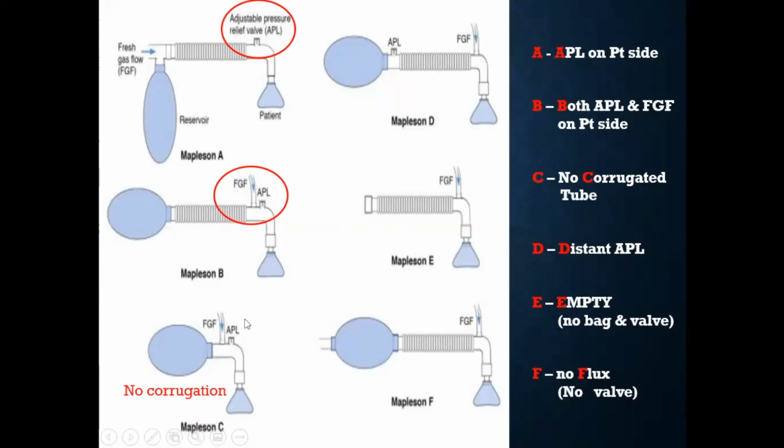Okay. Next, D, distant APL. This is a complete system again, but the APL is away. If you see in all the systems, only in D, the APL is distant, away from the patient.